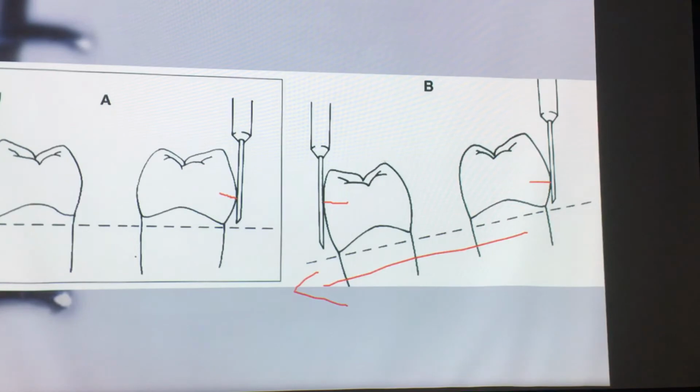Now, today's exercise, you'll be tripoding, analyzing, and identifying the undercuts on your first 2 models. And I'll demonstrate that later on. Here we've got some more visuals of a second molar, and there's an analyzing rod blown up here on the right, and you can see that the height of contour is here.